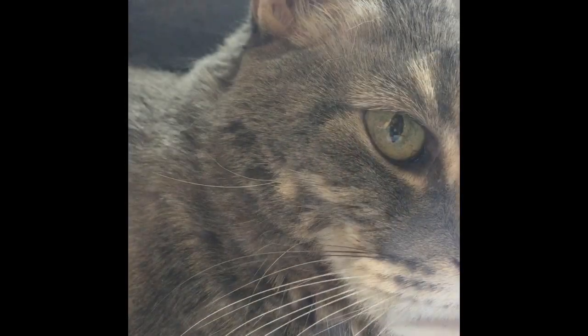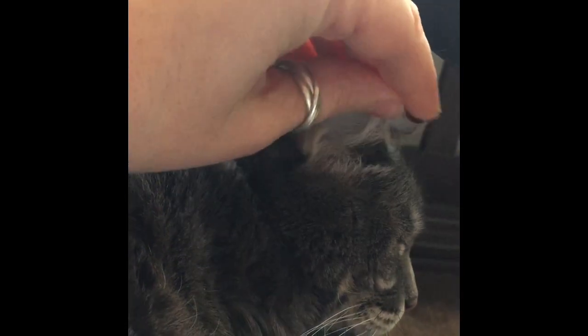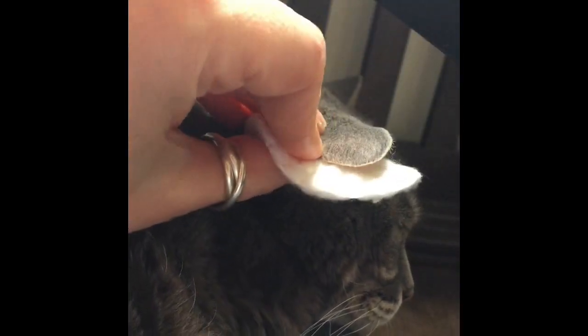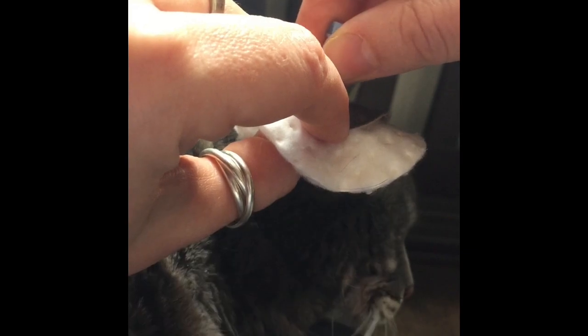I use the cosmetic round behind her ear and that will protect your fingers from getting poked. I'm going to set up the camera so you can see while I use both hands to test my cat. Luckily Cece is a pretty chill cat and she's just going to sit here for me. Some people warm up the ear with a rice sock beforehand. I don't bother because she's been tested for a while now and she's got all the little capillaries in there already — it doesn't take much to get a blood sample. I'm going to put the cotton pad behind it and give it a quick poke just along the edge.